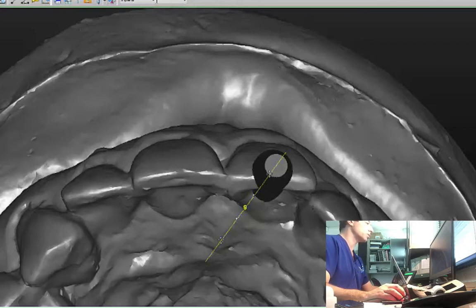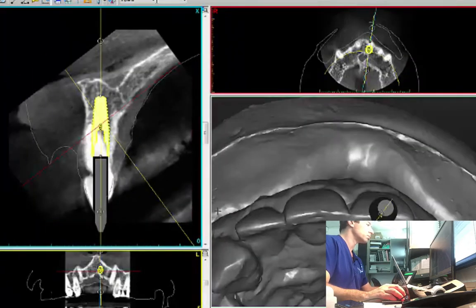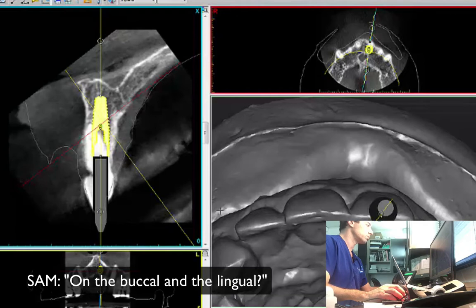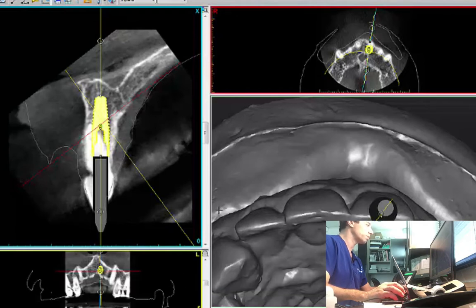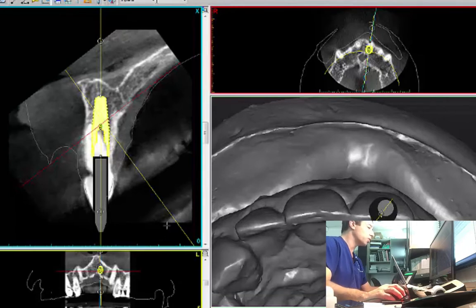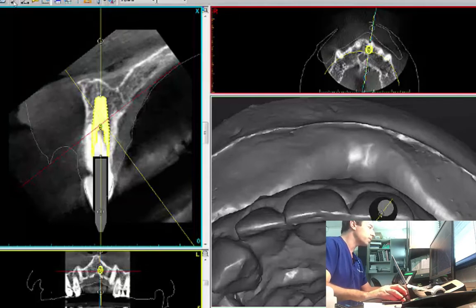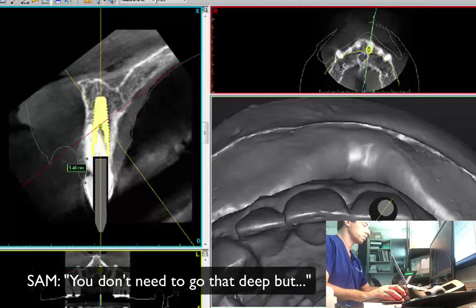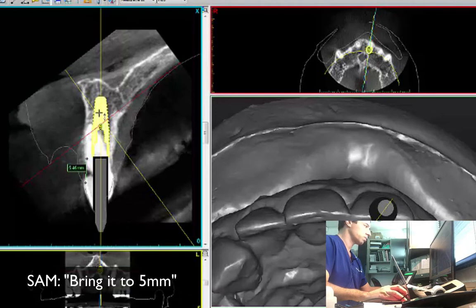And what is the reason we're doing this so far to the buccal? Do you have enough buccal bone now on the buccal and the lingual? Yeah, perfect. Okay, it's very good. What's the depth of the implant in reference to the tissue? We don't know the tissue roughly, but I can make a measurement. The measurement right now from the mid buccal level is 5.46 — a little bit deep. Yeah, you don't need to go that deep, but bring it to five.